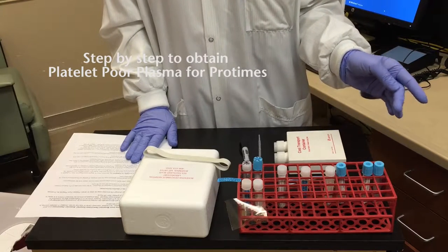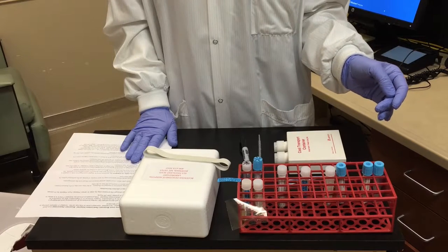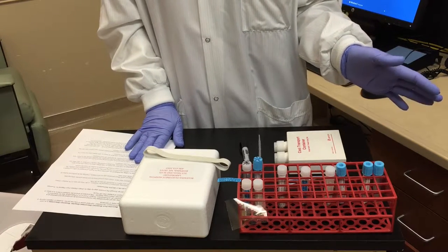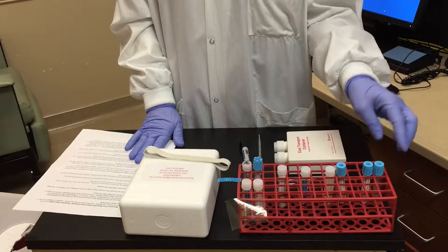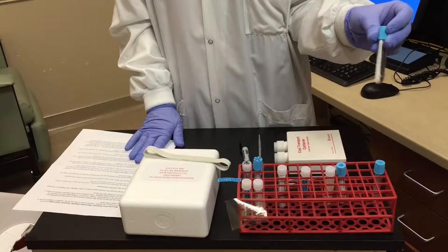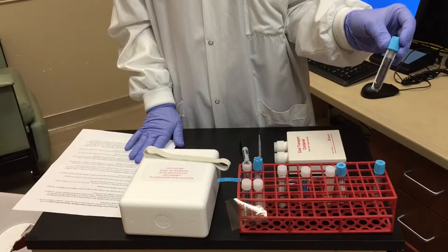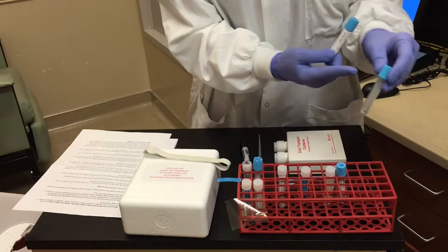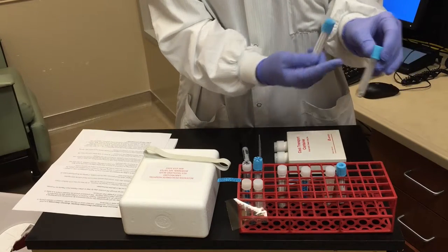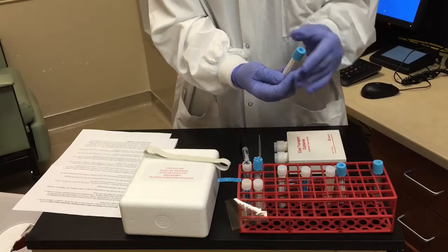We will now go through the step-by-step process to obtain the platelet-poor plasma for ProTime. For the collection instructions, the following specimen is required: a full blue top sodium citrate tube. Notice on the tube that there is a minimum fill line. The specimen needs to be up to that line in order to be acceptable.